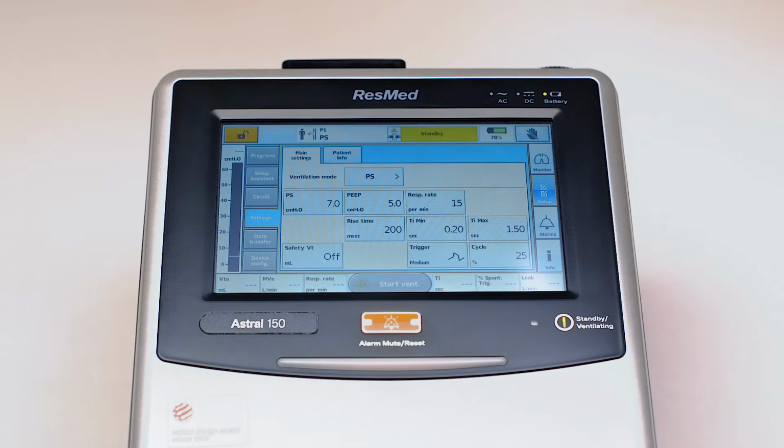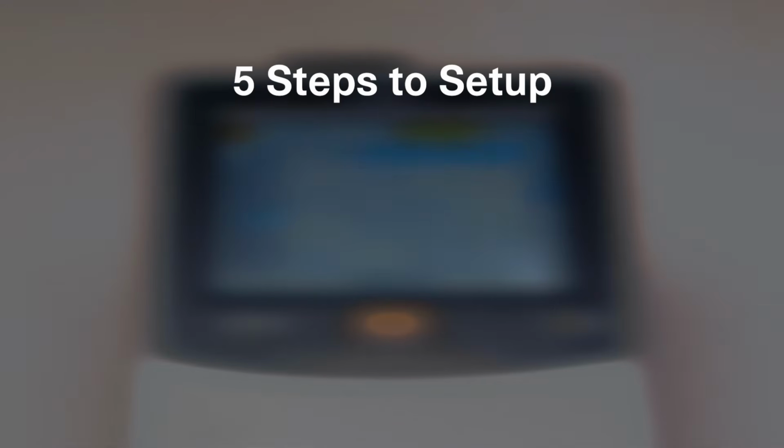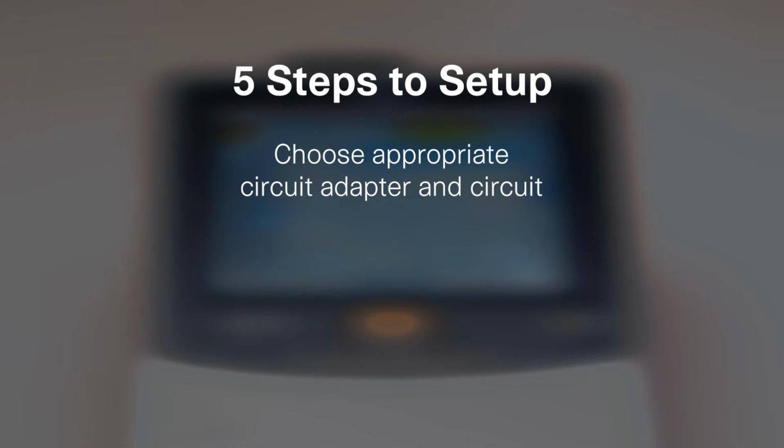Regardless of whether you're a new user of Astral or an existing user, we're hopeful that these steps to set up will help improve the efficiency of your patient setup so you can focus more time on your patient care. So the 5 simple steps to set up are: you have to choose the circuit that you want to use for your patient. You also need to choose the correct circuit adapter.